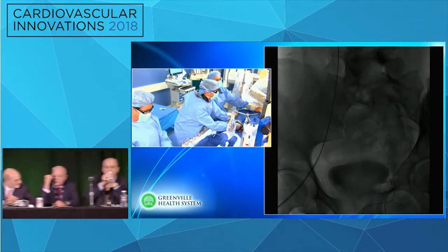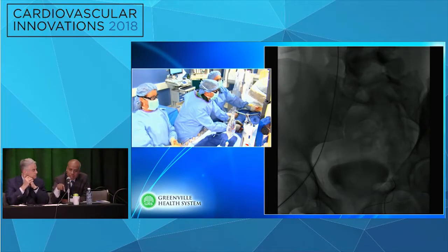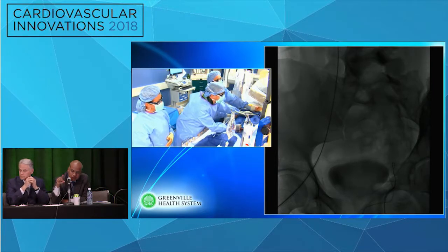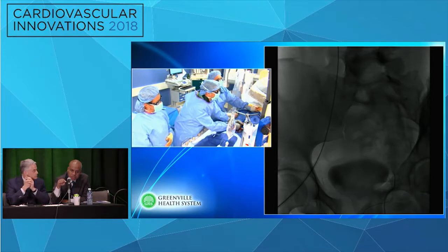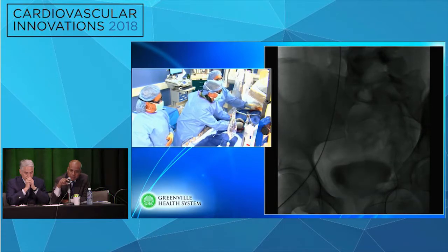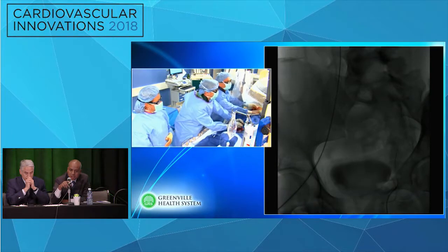I would abandon the common femoral because, okay, let's say that he gets back into the area where he wants to be, and then he crosses the stenosis. The real issue is that when he places the stent, he's going to miss that lesion there, and then your stent is going to have a problem with the inflow, and ultimately it's going to get thrombosed again. I think a better understanding of what's happening in that common femoral vein is going to be critical. I would abandon, even though it may be logistically more challenging.